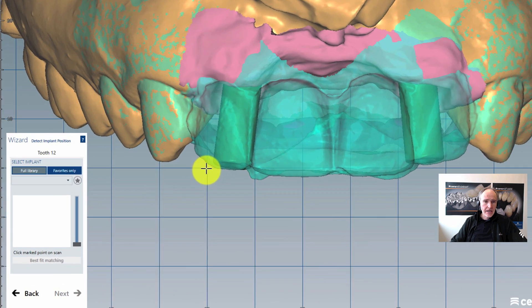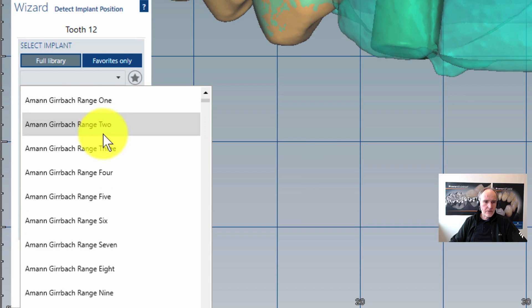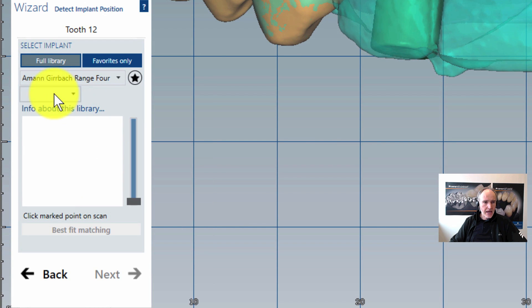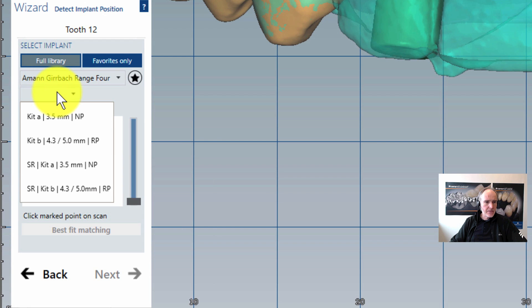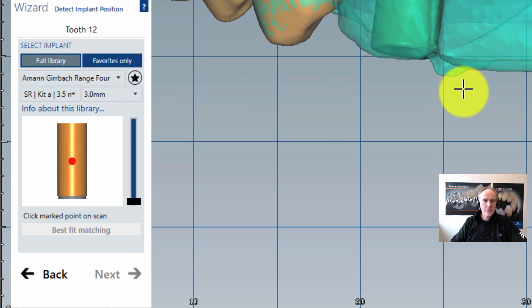Click on next and then I am selecting my abutment system. Here in our case we have a Range 4. Then we click on our system size — it's a screw retained kit A, 3.5 mm. The last thing we have to select is the height of the gluing part of this conical titanium piece we want to glue. I take the 3 mm one.